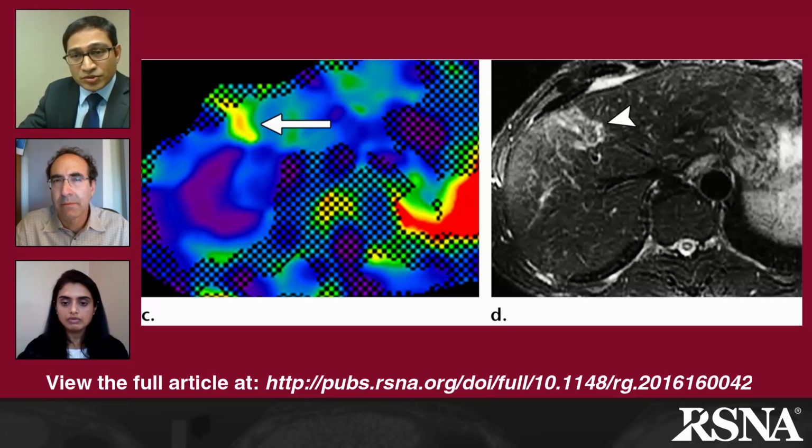And if we happen to do diffusion-weighted imaging in this patient, it will show restricted diffusion in the same place. And if we do arterial phase imaging, it will show arterial phase hyperperfusion at the same place. So all these correlate exactly to the same area of stiffness. Now, you might be wondering, how is this useful? Because if you do an ERCP in this patient and relieve the biliary stricture, that particular area of stiffness will go, really showing that there is a response to whatever intervention has been done.